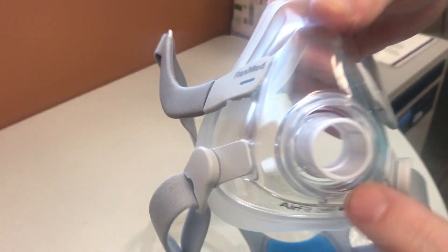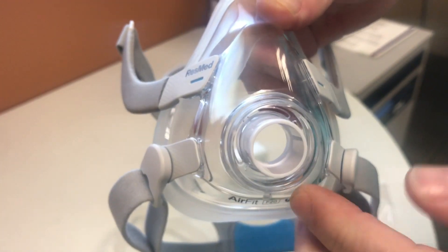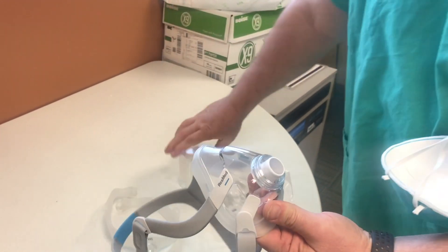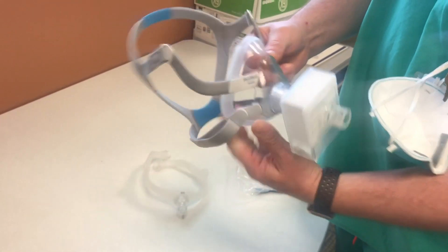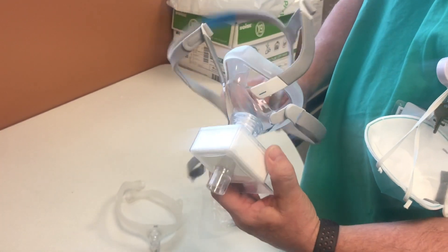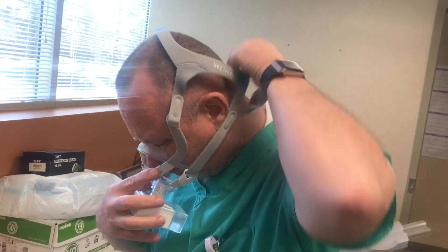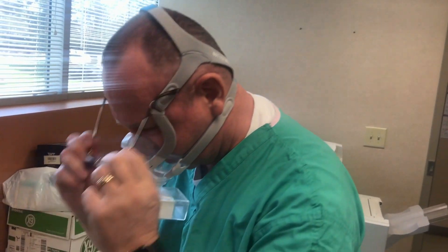If you look closely, you'll see those little slots around it. You want to put a layer of silicone caulk over those — I'm going to do mine on both the inside and the outside — and let that dry. What that does is allow your ventilator filter to just fit directly on. Now you have an N95 mask, basically an N100 mask, all things considered. So let me put this on — and there you have it.